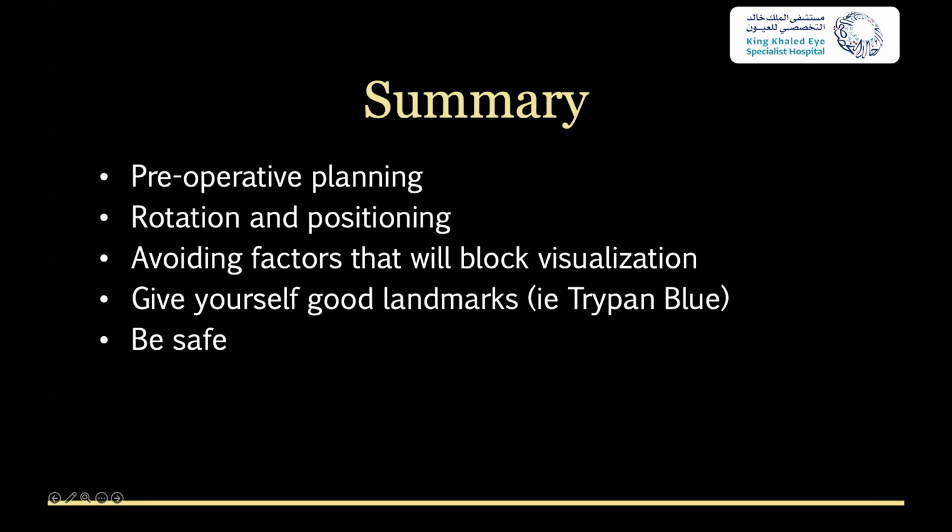So from the operative standpoint, I think making sure you plan ahead of time and pick your patients wisely. And then when you're in the OR, make sure that they're positioned correctly so you're giving yourself the best view. Sometimes using things like trypan blue can really help with that visualization, but then avoid things like corneal striae and blood, and then of course, above all, be safe.